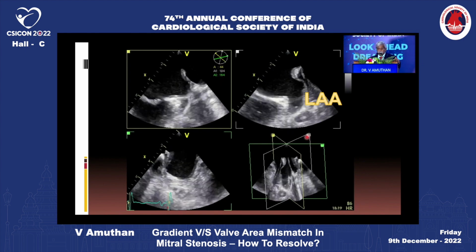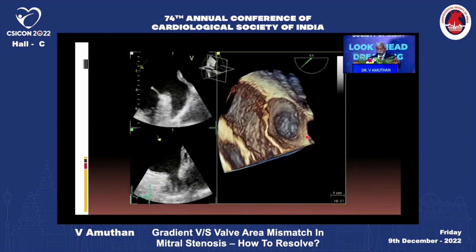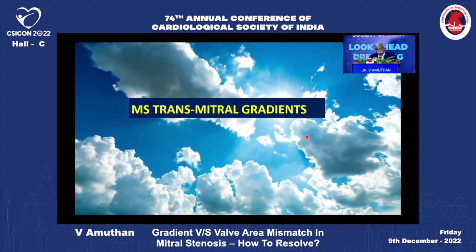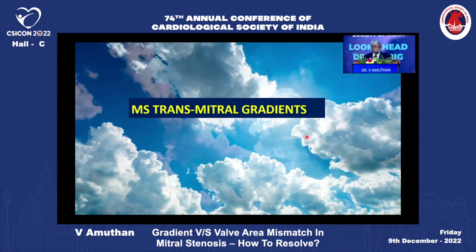This is the left atrial appendage. You always view the en face view. So that is how you look at the mitral valve and calculate the mitral valve orifice area.